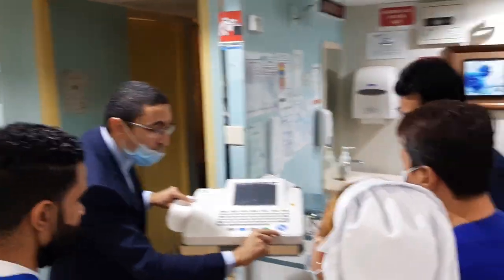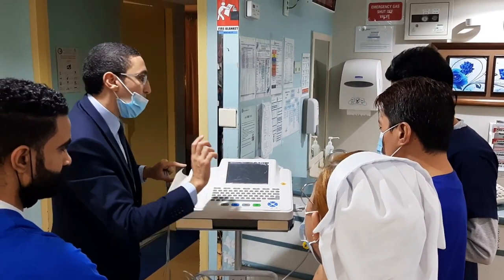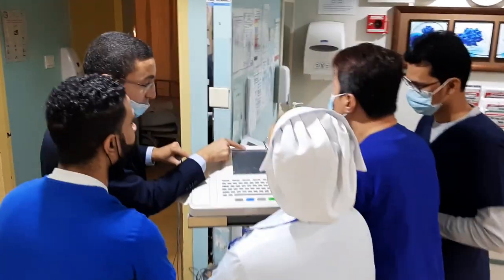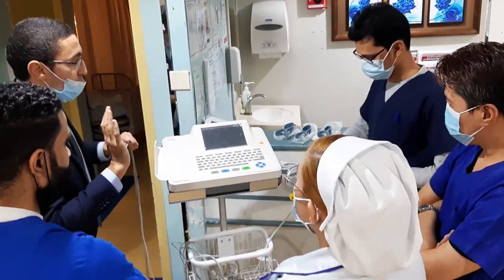Okay, and they're going to be full. This one, it will be like it. Actually, it's empty, near empty. Yeah, near empty. Okay, and actually, you have another indicator on the display for the battery. So you have it here and here. Same as this one. Yeah, you are right.